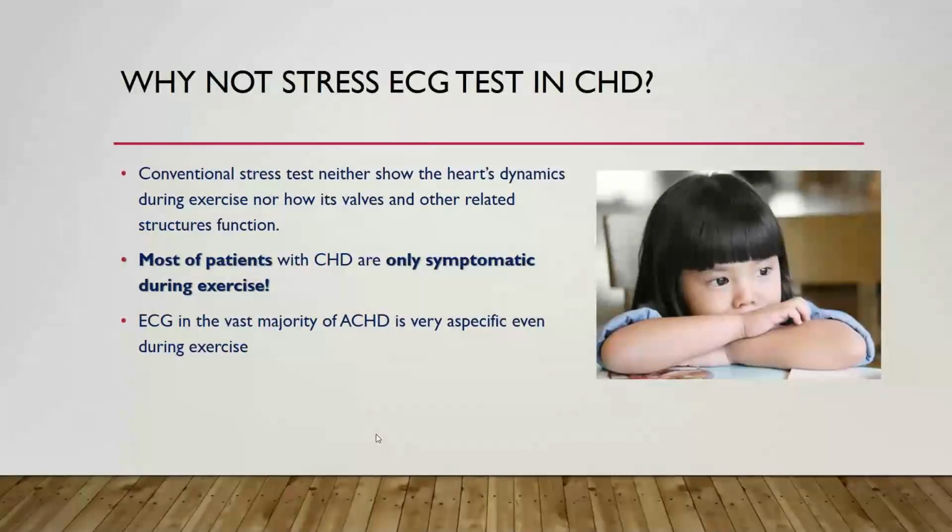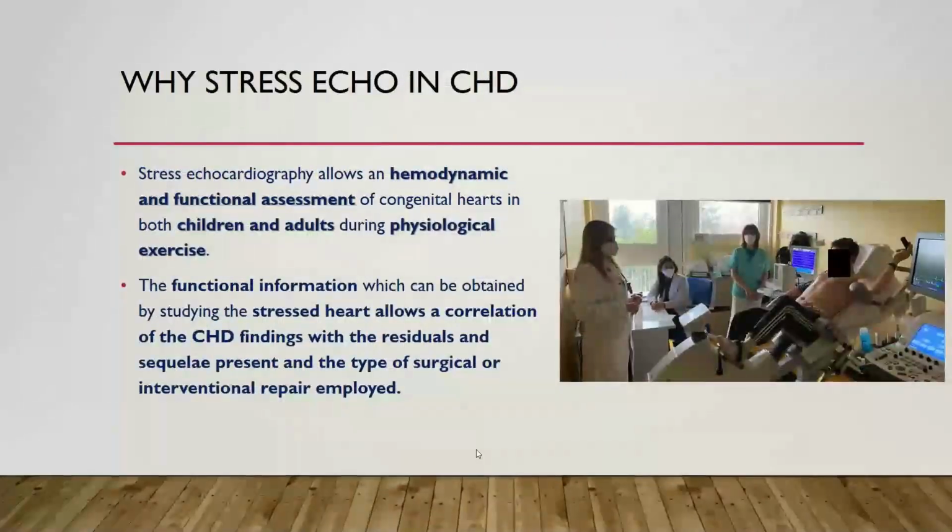Most patients with congenital heart disease are only symptomatic during exercise, so it's important to perform stress echo, physical stress echo in our patients, because many of them get symptomatic during exercise. And ECG in the vast majority of CHD patients is very nonspecific, even during exercise. By using stress echocardiography, we can obtain hemodynamic and functional assessment of congenital hearts in both children and adults during physiological exercise.